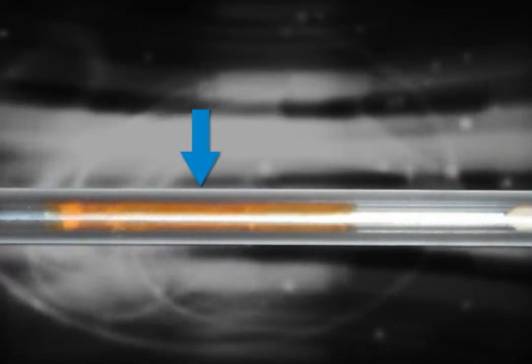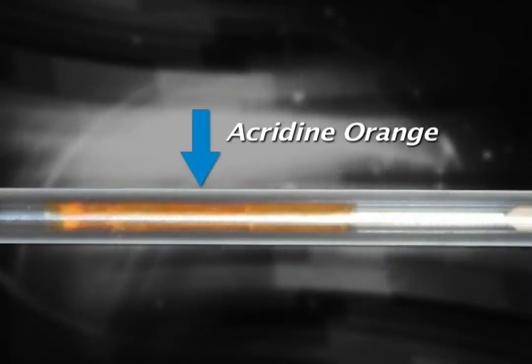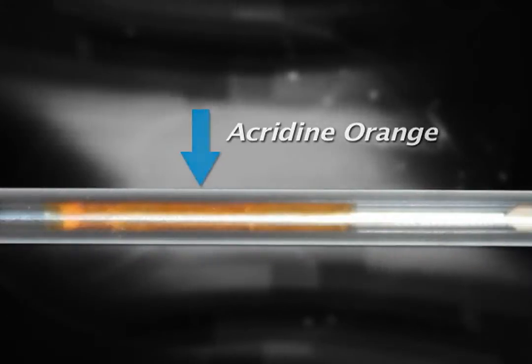Beyond the fill lines is an area of acridine orange dye. Acridine orange stains the white cells and platelets for recognition by the STAR unit.